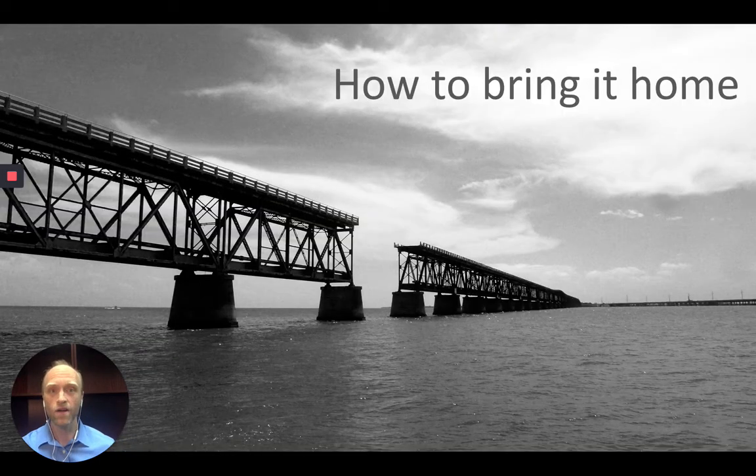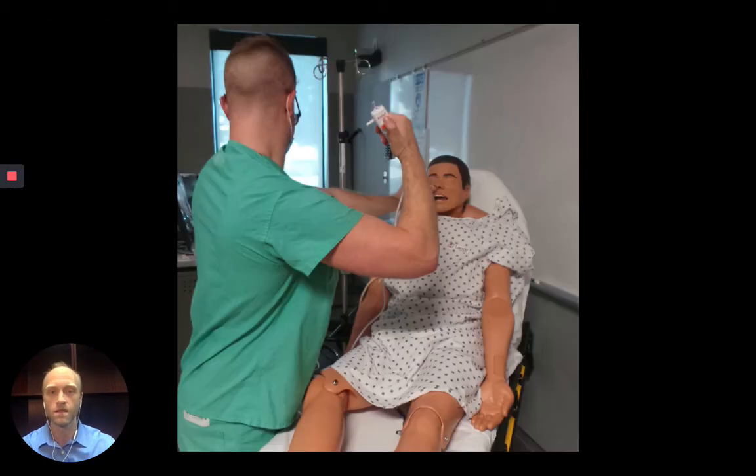So lastly, I'd like to leave you with some ideas on how to gain competence and confidence in performing this skill. So the first step is working with your department and hospital leadership to obtain access to the necessary equipment and medication. And once you have that in place, all it is, is practice. I recommend simulation as a first step to obtain a basic skill set with driving the flexible endoscope.